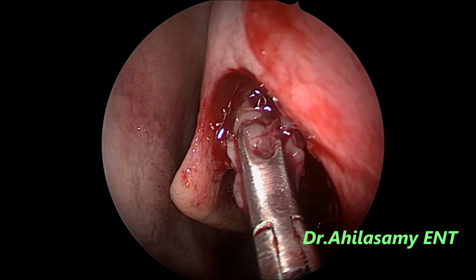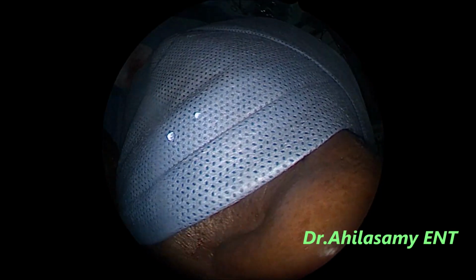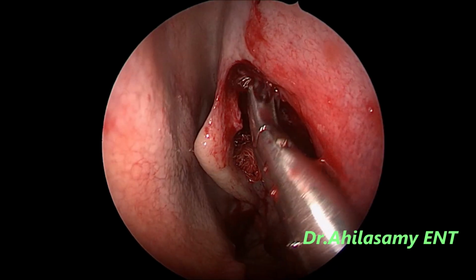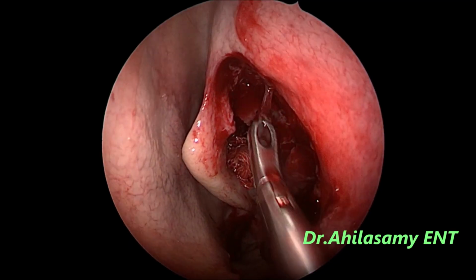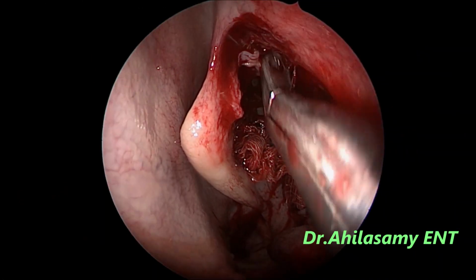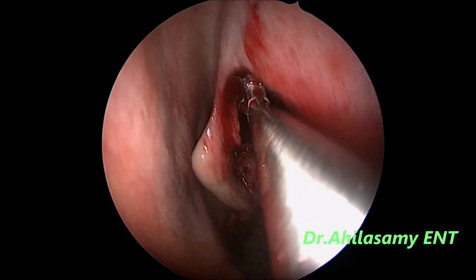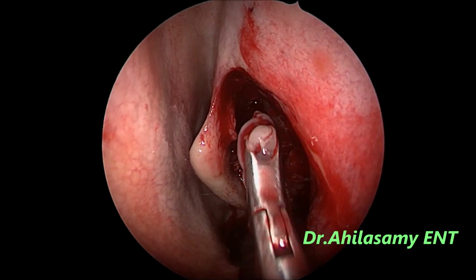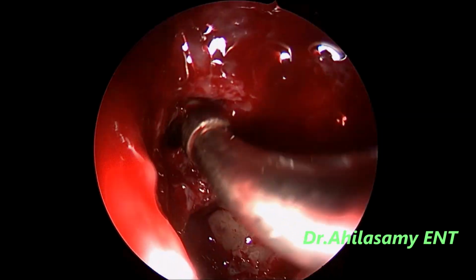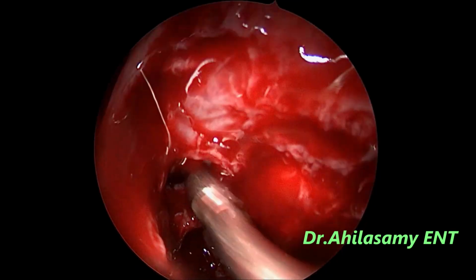Now I am going for the frontal, clearing the frontal recess with the 45-degree Blakesley forceps. Next, I will go for the 70-degree telescope and clear all the blockage in the frontal, which is all opaque in the CT scan coronal study. More polyps there, you have to clear all of them. Now I am going for a 70-degree telescope. That's a curved sucker in the frontal, but still a lot of polyps blocking it.